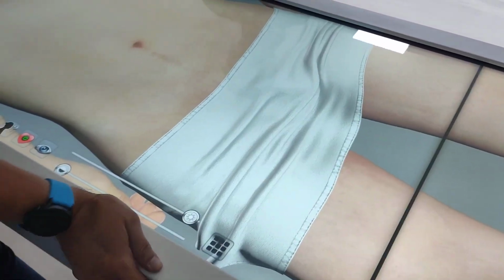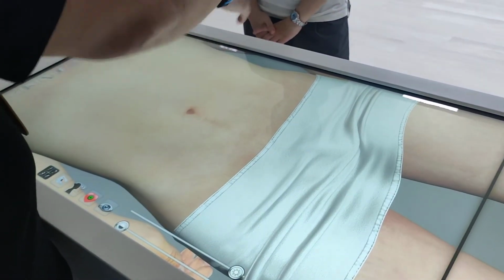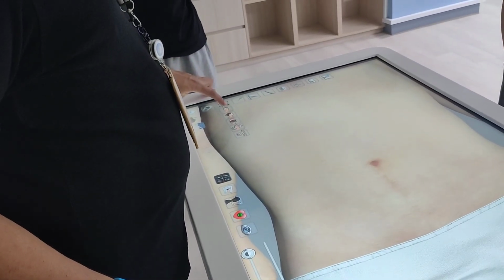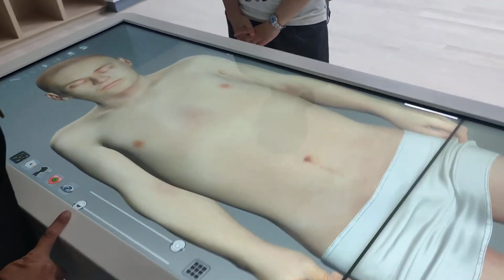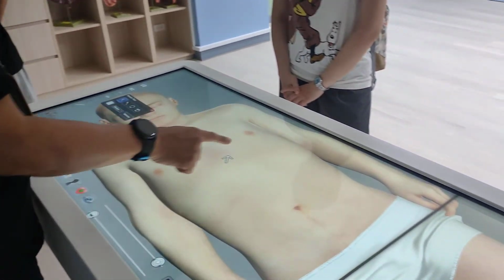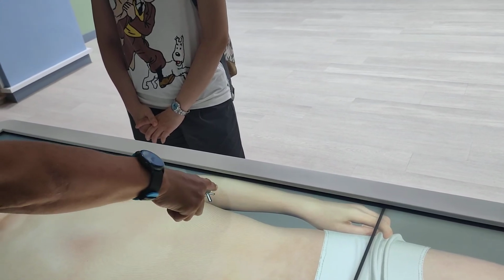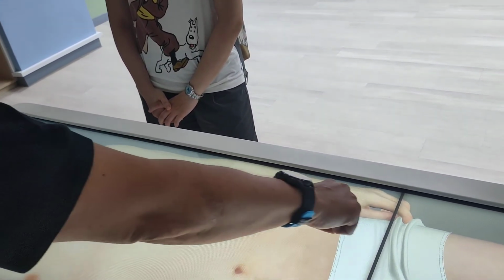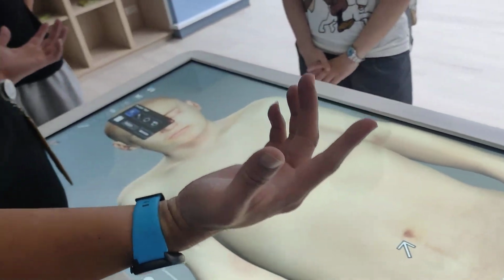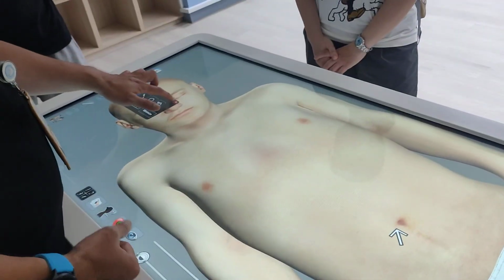Okay. So, like this one, currently the cadaver is too big. It is already out of the screen, so you can do here and press the first one, and it's going back. Okay. This one is simply just a slide. You can point. Like I want to point out, this is a forearm, this is a finger, and this is umbilicus. And I don't think that's... I can't tell you the further function of this one, so it's useless.